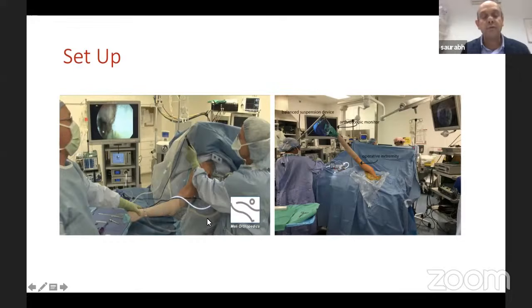So starting with setup, there's two ways we can do shoulder arthroscopy. I would do what I've shown on the left side of the screen, a beach chair position. This is not me, but this is where the surgeon stands. That's the monitor. There's the assistant holding the arm for you. You can always have an arm support if you want to. The advantage of the assistant holding the arm is you can move the arm as you need while doing arthroscopy.